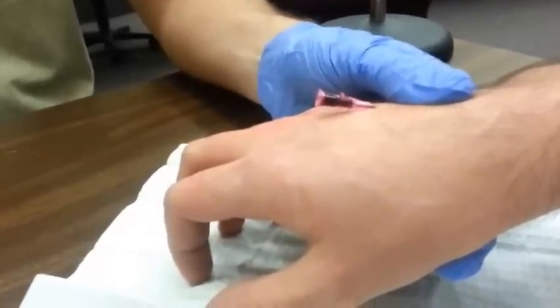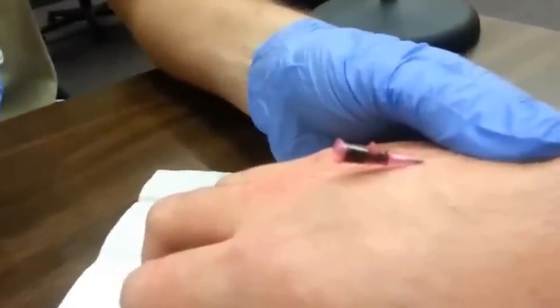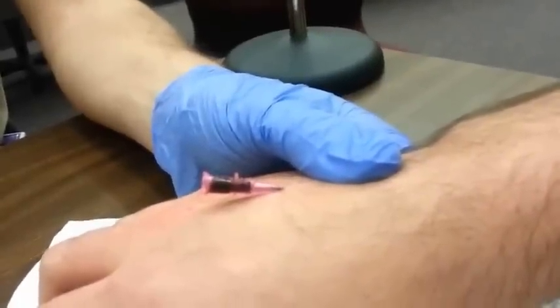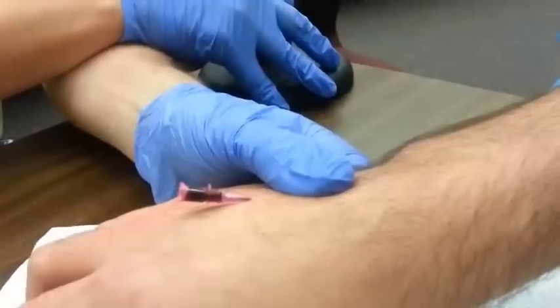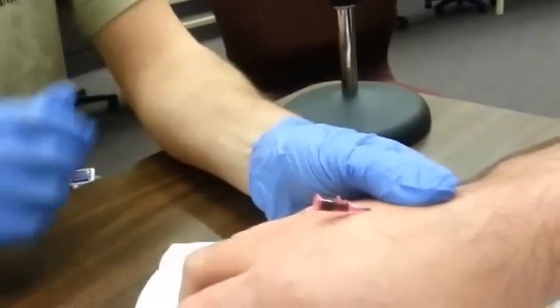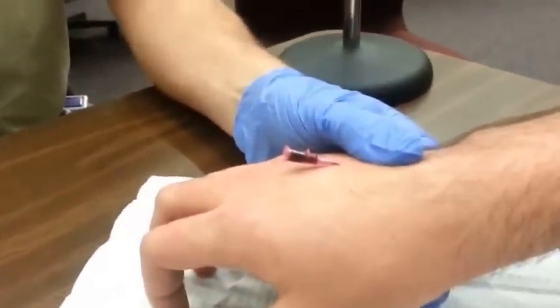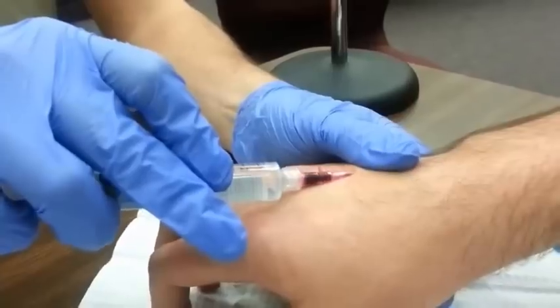After we do this, we will need to stop the bleeding. Blood has started to come out of our catheter. Our practitioner has applied pressure proximal to where the catheter enters the skin, thus impeding flow out through the catheter. Next, the practitioner will remove the tourniquet with the one-handed technique.